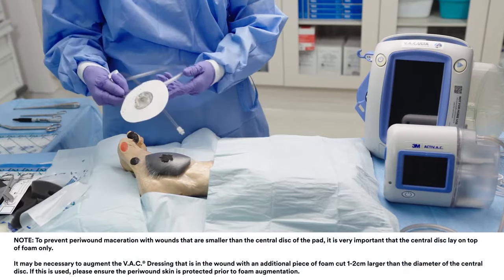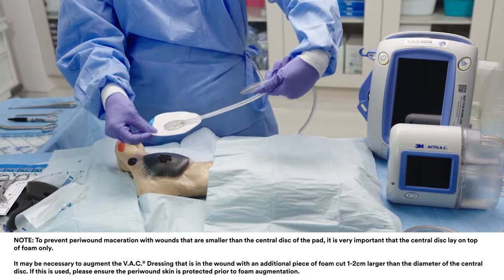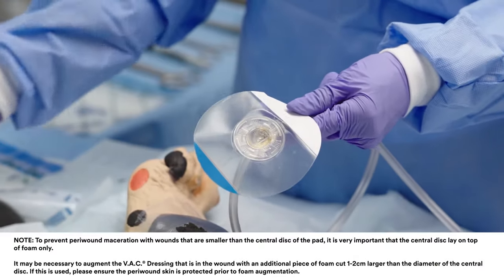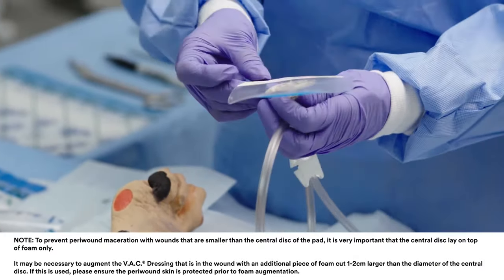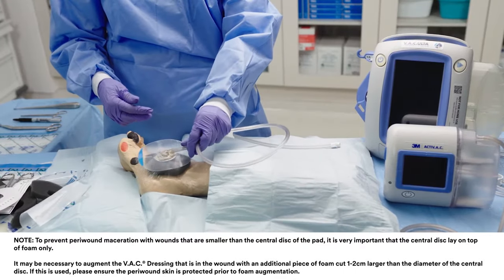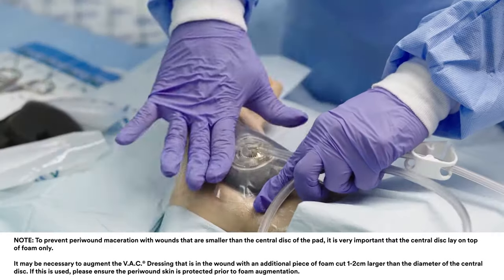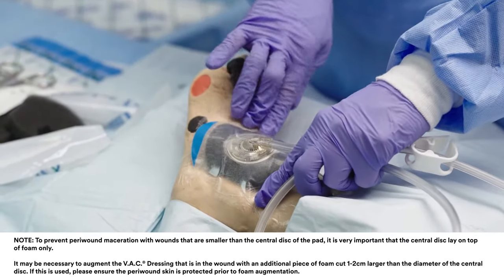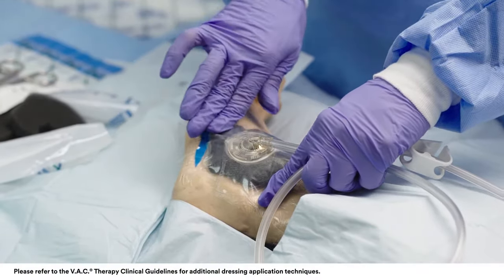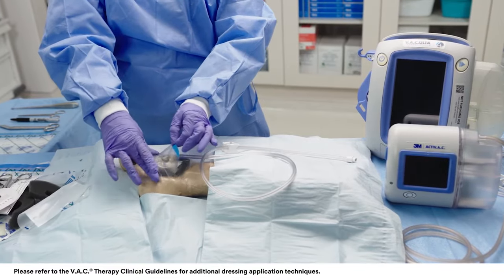Apply the pad, which has a central disc and a surrounding outer adhesive skirt, to the larger piece of foam. Remove both backing layers 1 and 2 to expose adhesive. Place the pad opening in the central disc directly over the hole in the drape. Apply gentle pressure on the central disc and outer skirt to ensure complete adhesion of the pad. Pull back on the blue tab to remove the pad stabilization layer.